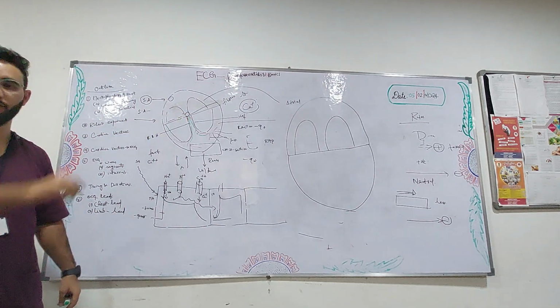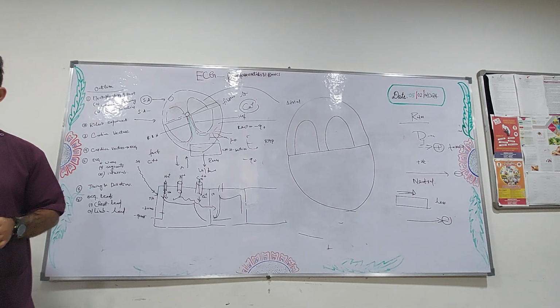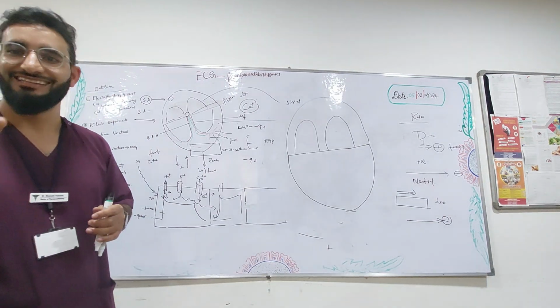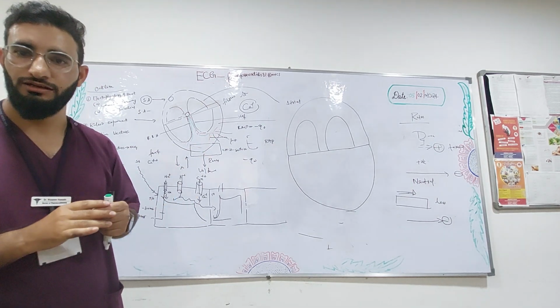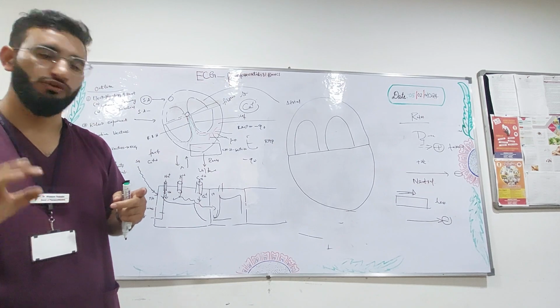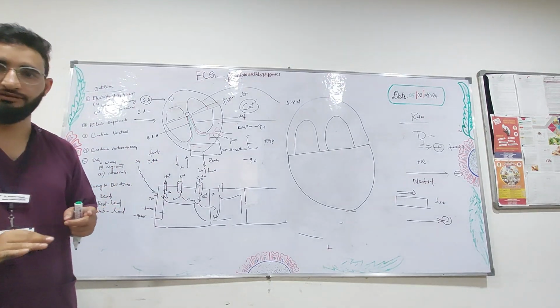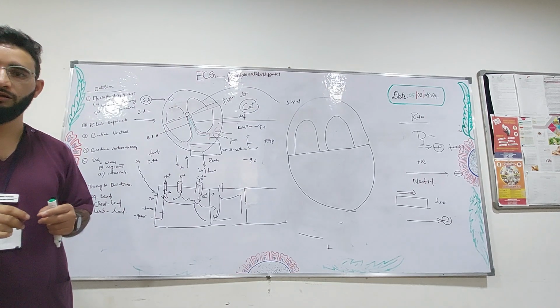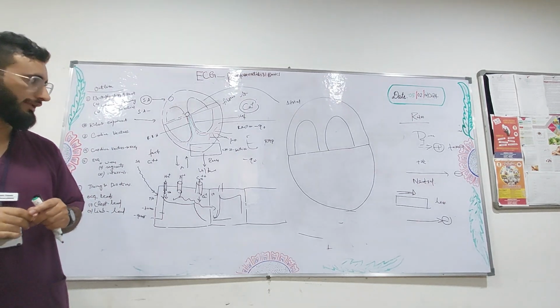Negative and unexpected negative, positive. Dr. Sudeshna, you tell me, the ECG machine works on the principle of the galvanometer. Now you tell me which ion channel is faster and which is slower. Slow.